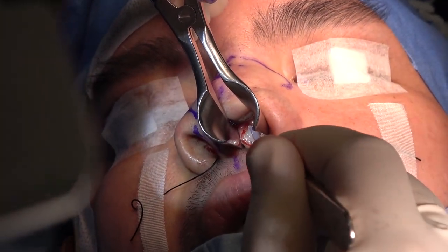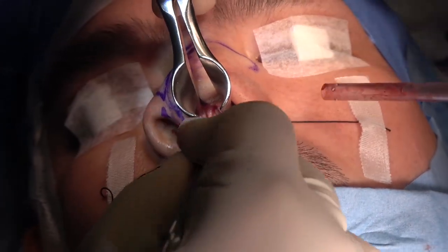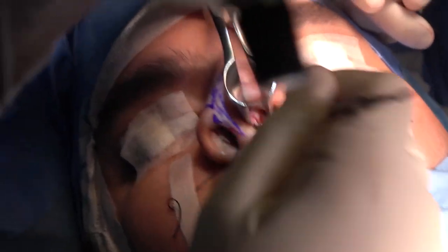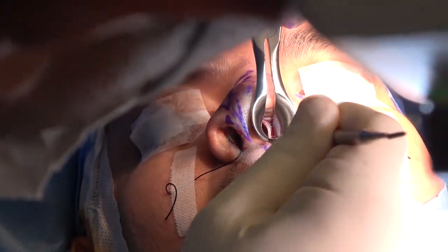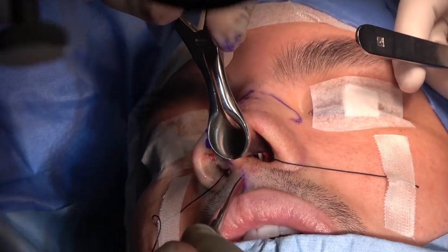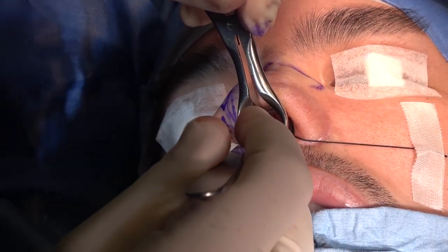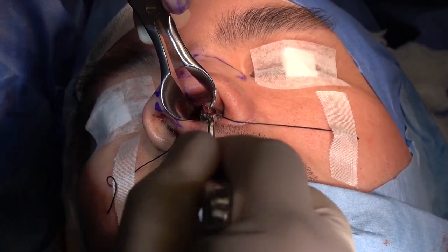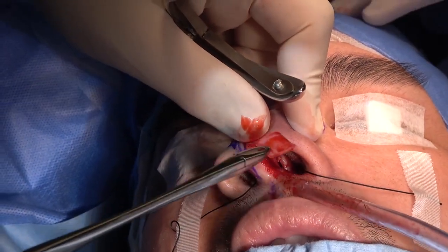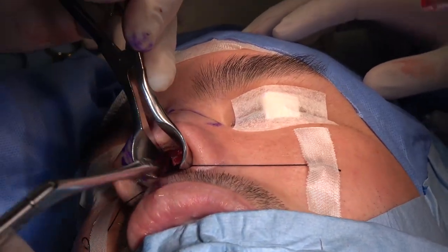Again, we go about 1 centimeter behind caudal septum, inside the cartilage, get access to the right mucoperichondrial flap. Again, hopefully you are on the right plane. Now you see the cartilage in between the two blades. Patient has got a deviated septum. I don't think he got a large piece of cartilage. Let's try to see what we can get. Yeah, I was expecting so, because he is over 40. So that's what we got only. That means we are going to use the conchal graft mainly for the tip.